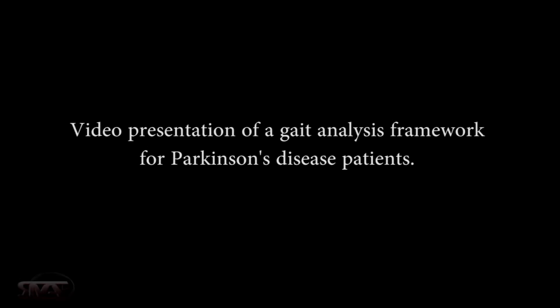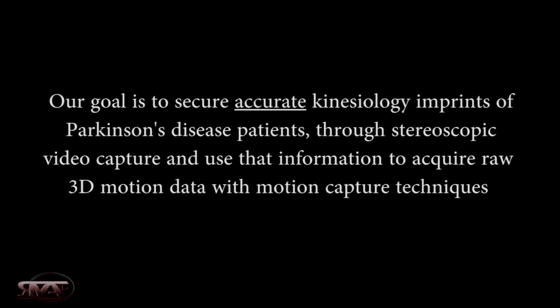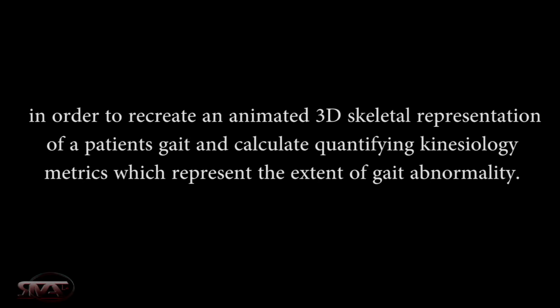Hello, this is a video presentation of a gait analysis framework for Parkinson's disease patients. Our goal is to secure accurate kinesiology imprints of Parkinson's disease patients through stereoscopic video capture and use that information to acquire raw 3D motion data with motion capture techniques in order to recreate an animated 3D skeleton representation of a patient's gait and calculate quantifying kinesiology metrics which represent the extent of gait abnormality.